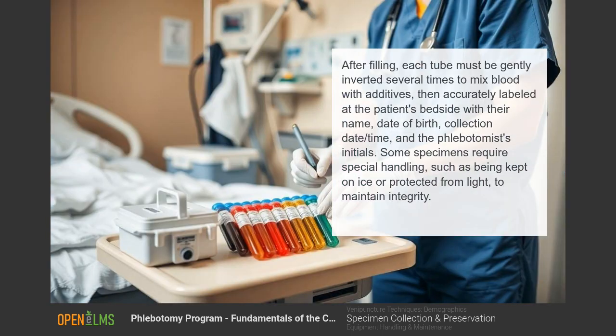After filling, each tube must be gently inverted several times to mix blood with additives, then accurately labelled at the patient's bedside with their name, date of birth, collection date, time, and the phlebotomist's initials.